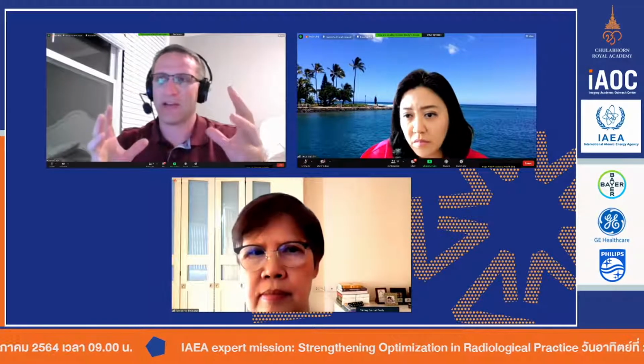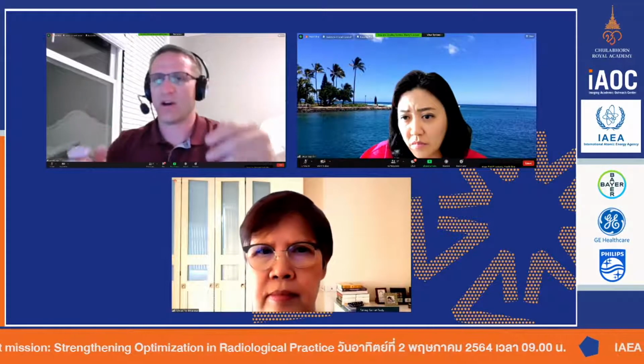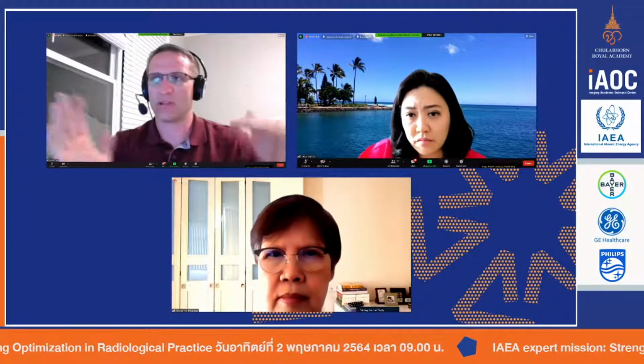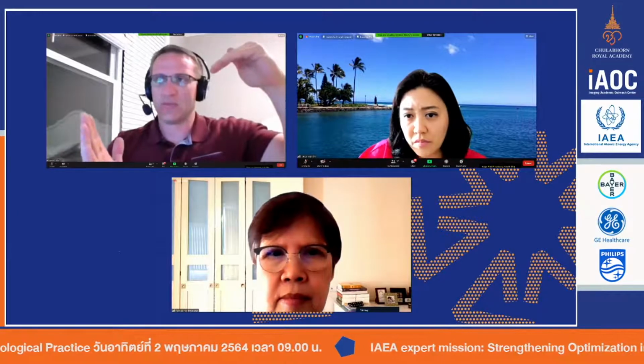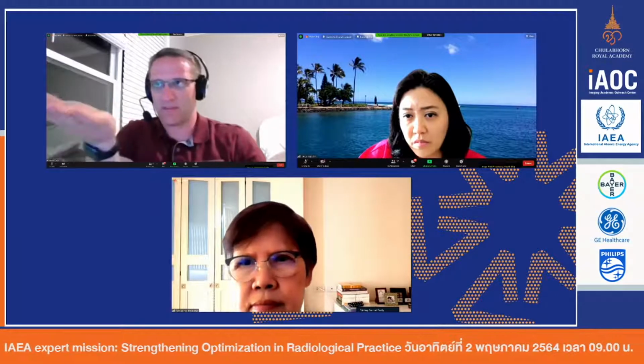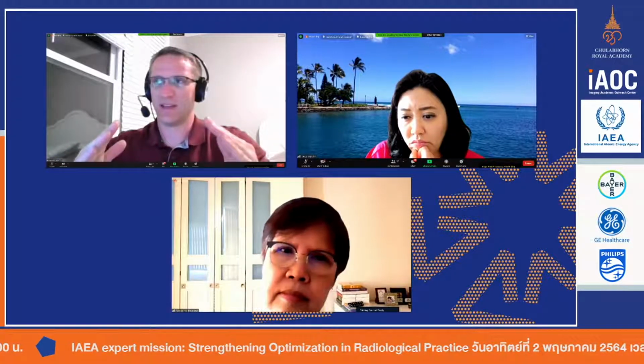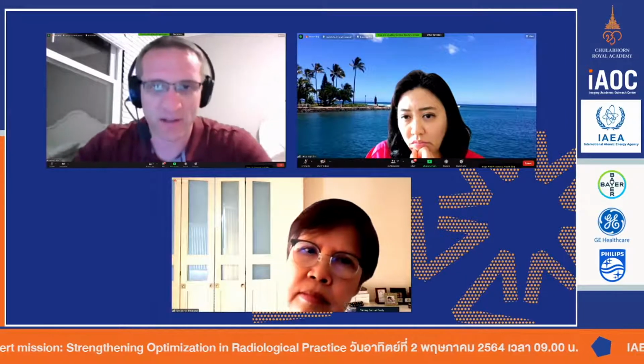I know there's all kinds of angles that you're imaging as technologists. When you have to get really strong, really distinct angles, you almost always have to take the detector out and move it with the tube. In a perfect world, you will always align the X-ray beam perpendicular with the detector. That's not always possible. If you have the detector in the table and need to make a very small angle change, it's probably not going to be that big of a deal. But when you start to make very large angles, because the grid is expecting a perpendicular beam and it's coming in at an angle, then you get this effect.